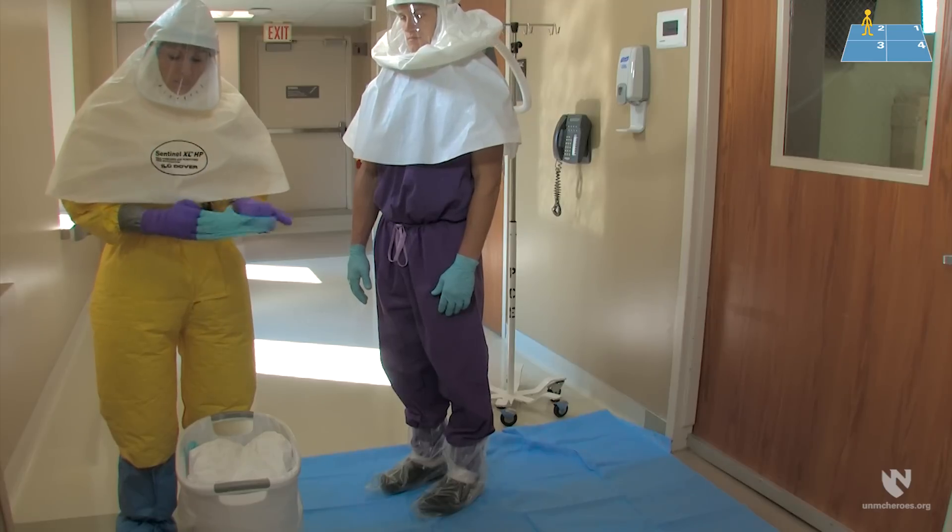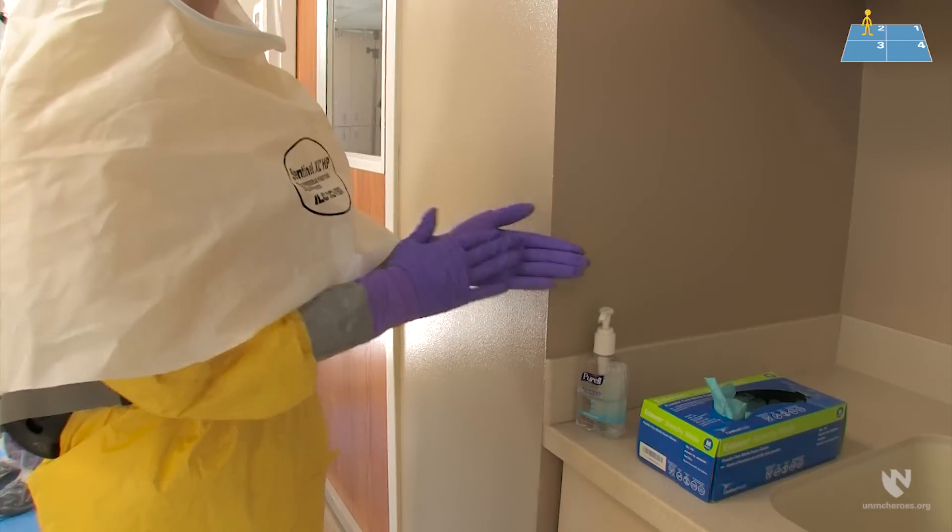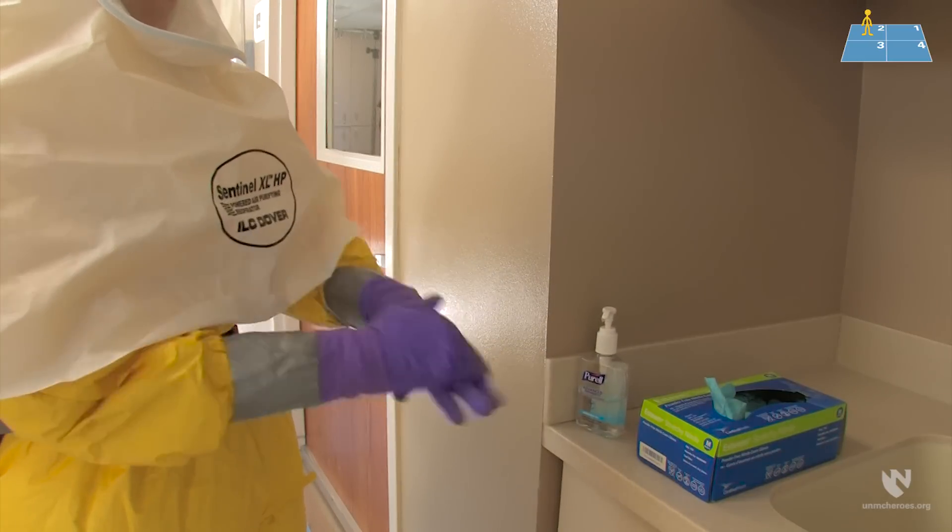The healthcare worker and doffing partner should now remove their gloves using glove-in-glove technique and place the gloves gently in the trash. Both should then perform hand hygiene and re-glove.